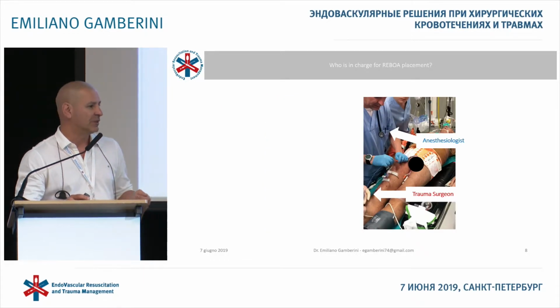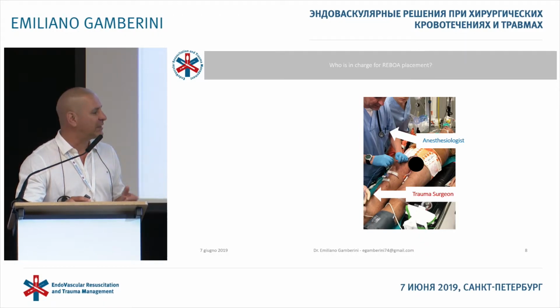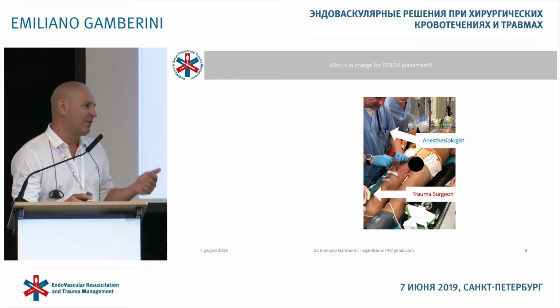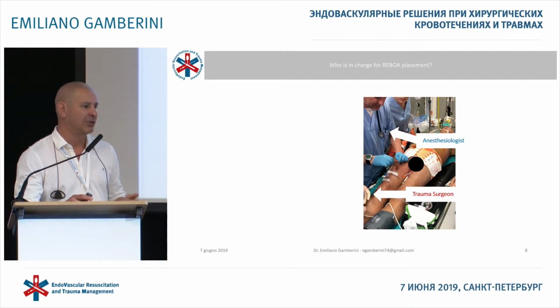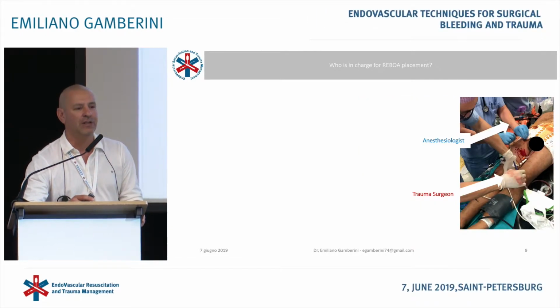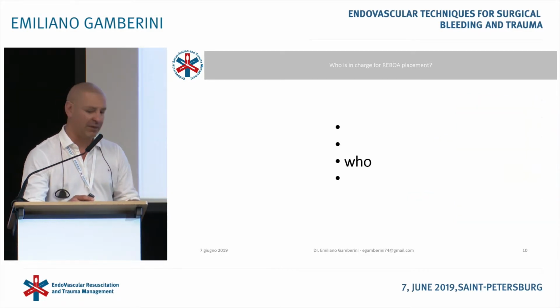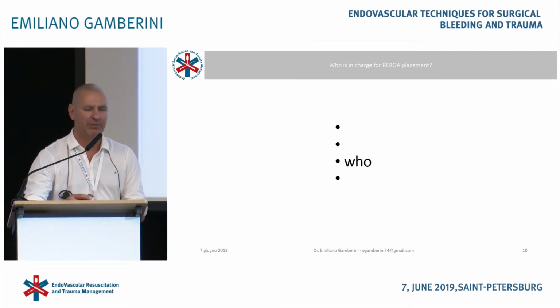In the third picture, you can see that the shock is ongoing, so the trauma team decided to insert a REBOA. The PPP was completed and the pelvic binder was closed again, but the patient was still in shock, so REBOA was inserted. In the fourth picture, you can see the trauma surgeon, my friend Federico, checking the balloon position and fixing the balloon to move to definitive treatment.